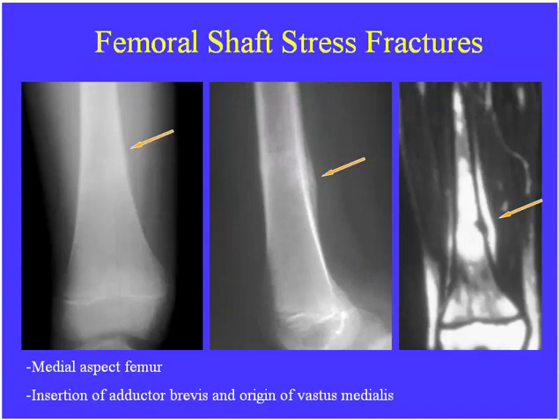Moving down to the mid-thigh, stress fractures can occur here too. We see abnormal periosteal reaction that looks somewhat aggressive, but closer look on plain film shows a linear area running transverse to the long axis of the femur. On MR, the same little linear area of low-signal abnormality runs perpendicular to the femur. The key is the perpendicular low-signal black line — don't misinterpret this as Ewing sarcoma, lymphoma, or osteosarcoma.